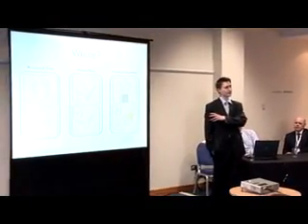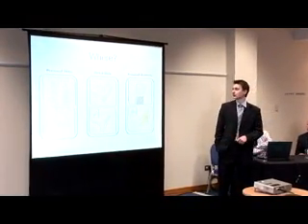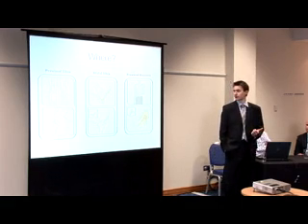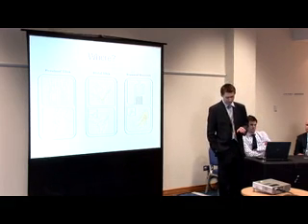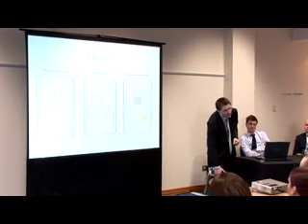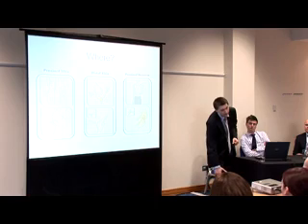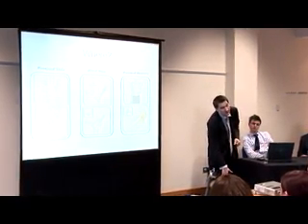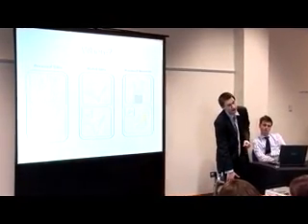Well, it doesn't matter which device you're using. These are the landmarks. So the proximal tibia is the one that you commonly use. So if you have a feel down your own knee, and you get the soft part, a little bit distal, just anteriorly, there's a prominence there. Go 2 centimeters medial, and there's a big flat part of bone in there. That's where we're going, all right?